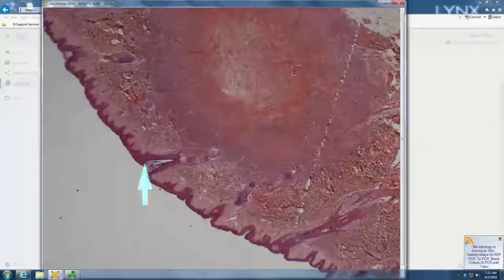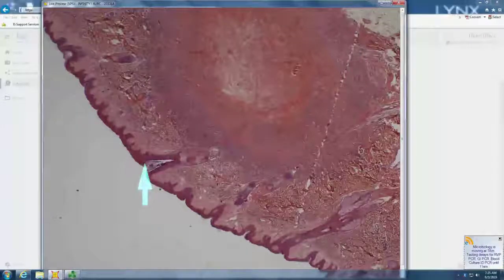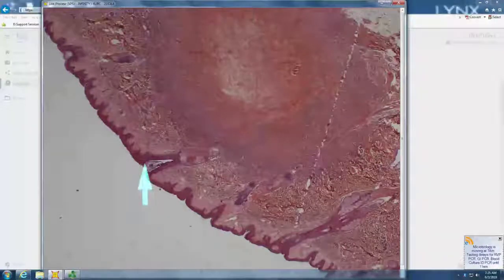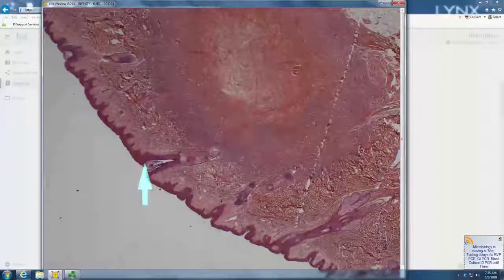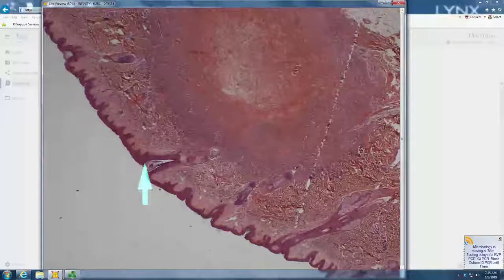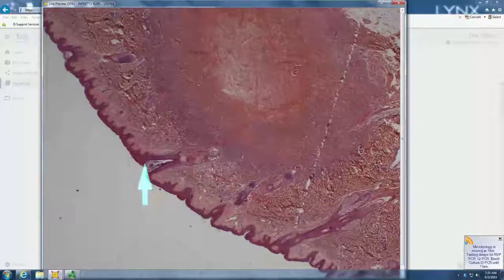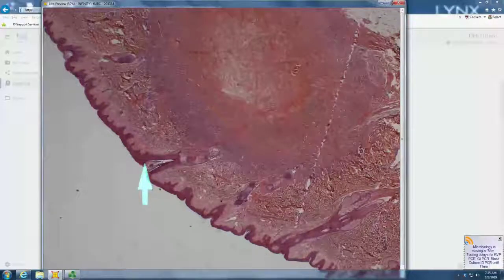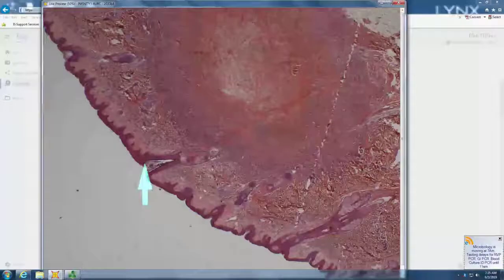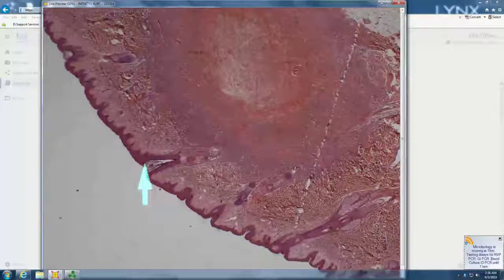Dermatofibroma. And characteristic of DF, as you follow them over time, is they develop those hypocellular areas, whereas a DFSP is uniformly cellular across the field. So DFSP is a classic translocation sarcoma. Translocation sarcomas don't have much atypia. They just have far too many nuclei, and they're uniformly cellular across the entire field.